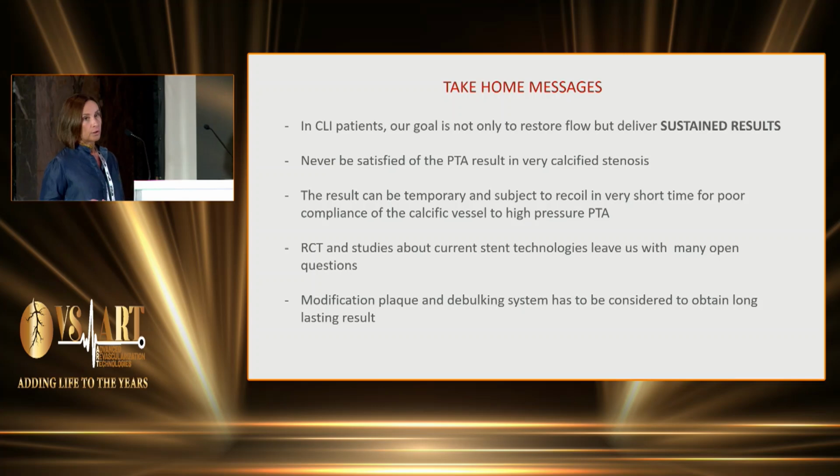We need to work on vessel preparation. We need a randomized controlled trial to know which technologies really work and are worth our money. But I think we can all agree that plaque modification and debulking is something we have to focus on to obtain better results.